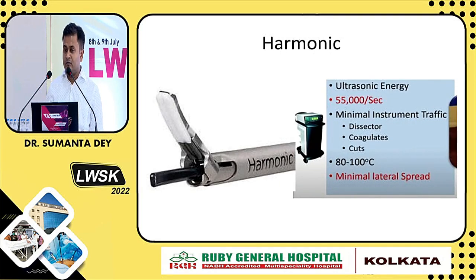The most important one is the harmonic. Harmonic is very handy. It uses ultrasonic energy, and this is the active blade, and this is the gripping blade. This whitish one is used for gripping the tissue, and the active blade vibrates at 55,000 per second. It causes so much vibration and converts sound energy into heat energy. It can be used as a dissector, it can coagulate, it can cut, and it produces a temperature of up to 80 to 100 degrees with minimal lateral spread, only 1 to 2 millimeters.